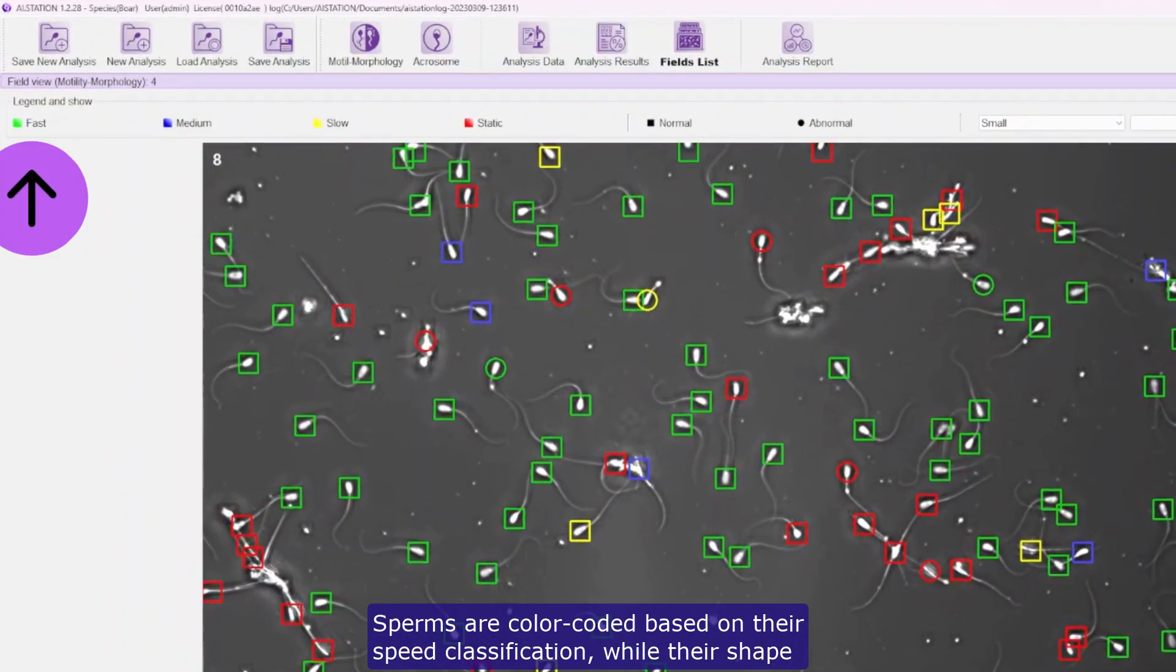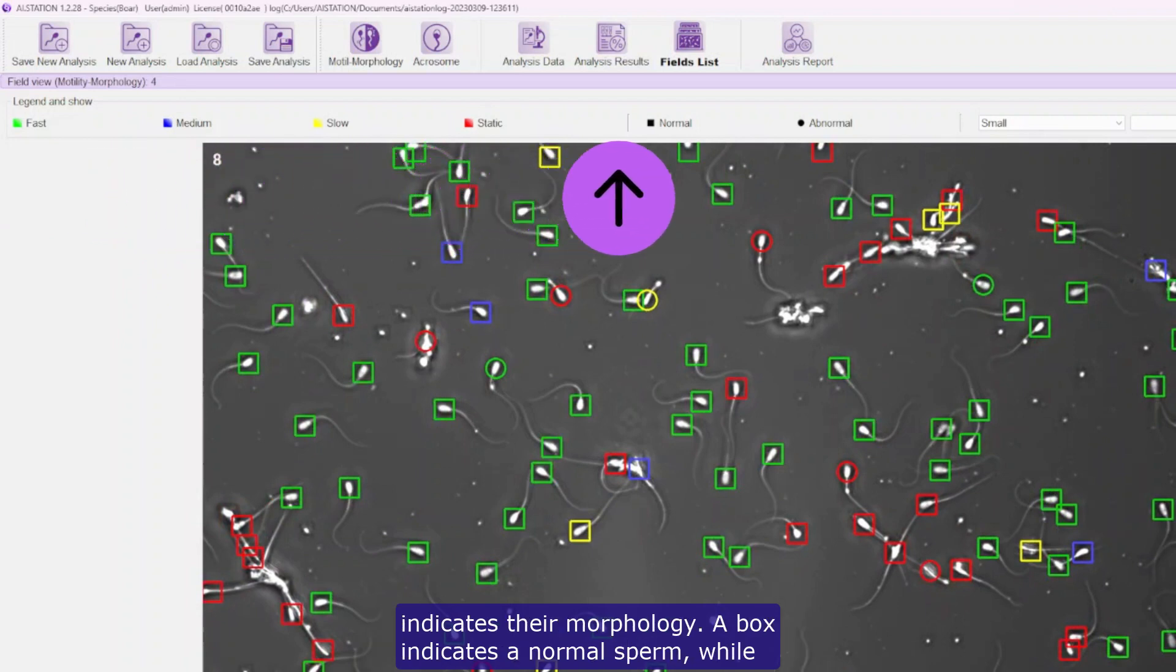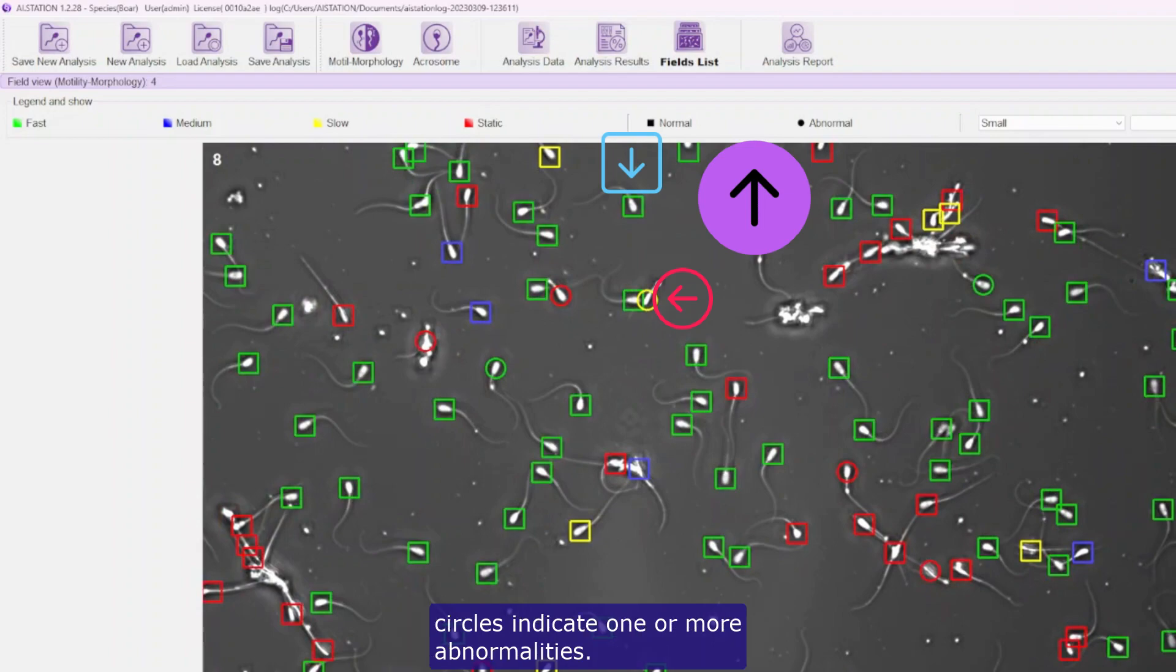Sperms are color-coded based on their speed classification, while their shape indicates their morphology. A box indicates a normal sperm, while circles indicate one or more abnormalities.